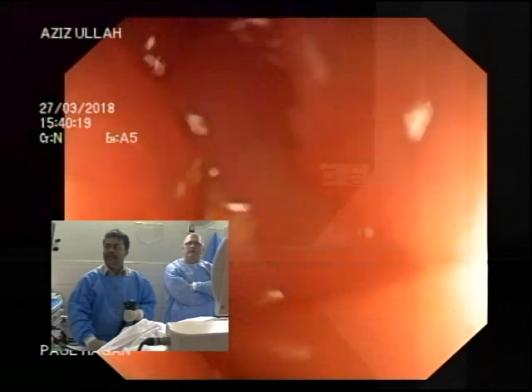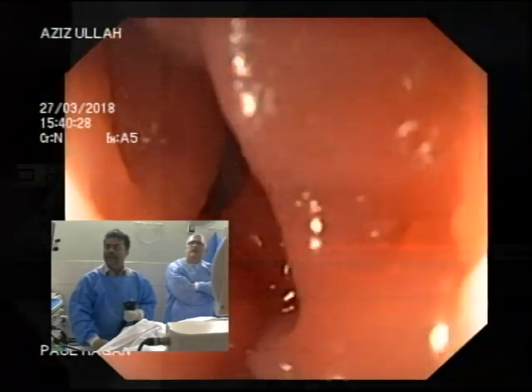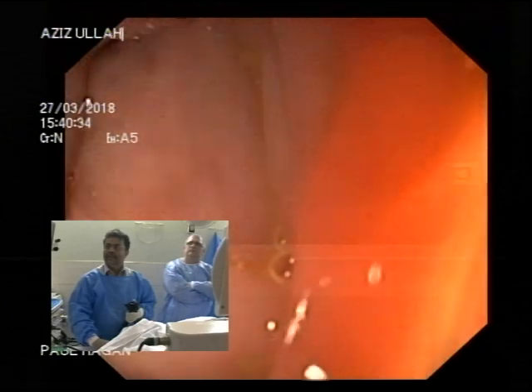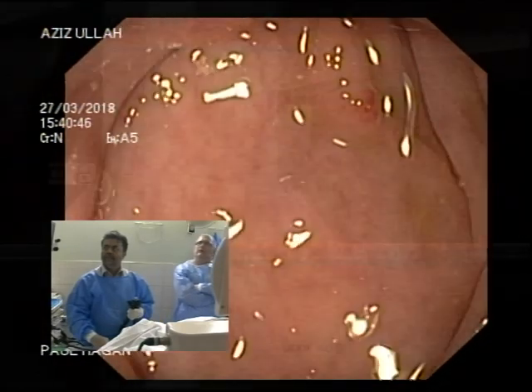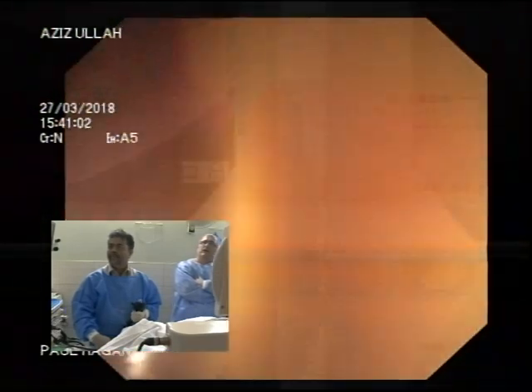Blow. Advance. Blow and advance. Good. Go on. So it's unlikely that this is down to the prep. That one is, but that one doesn't look like it's prep. So you need some more air. Come on. Good.